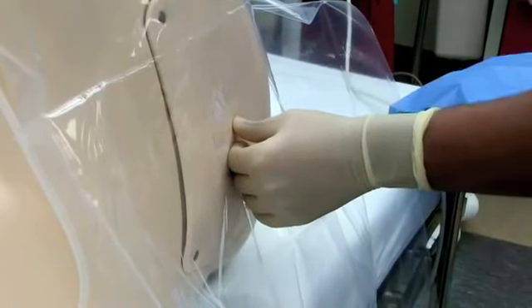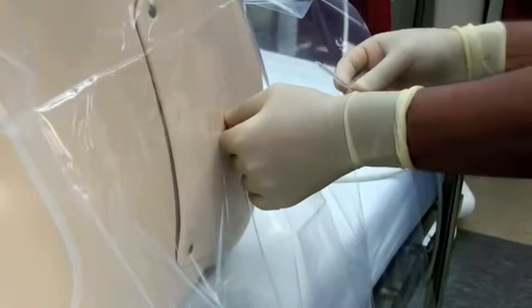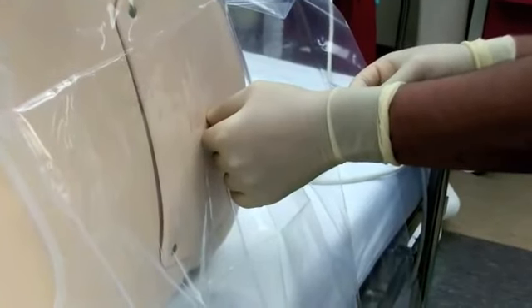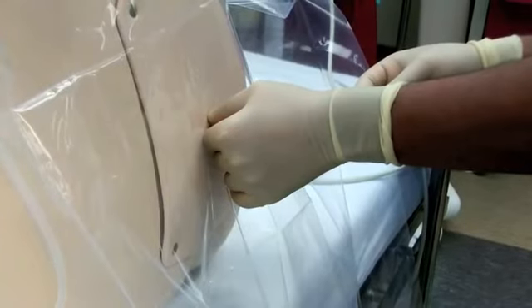With the introducer needle, in the middle of the interspace with slight cephalad angulation of 10 to 15 degrees. The bevel of the spinal needle should be in the sagittal plane and advance in orientation as described above.